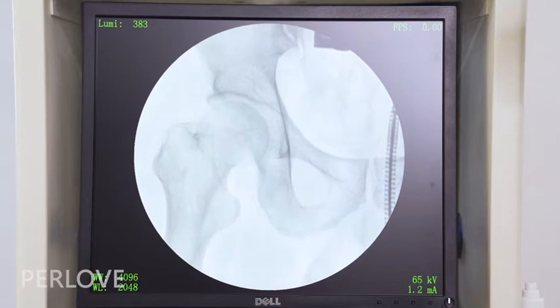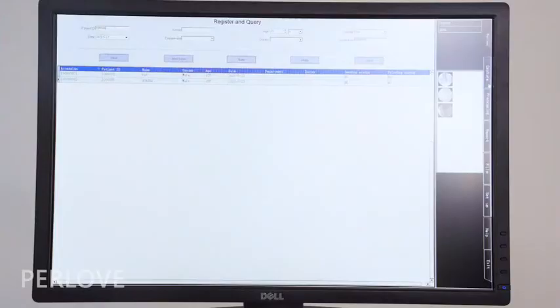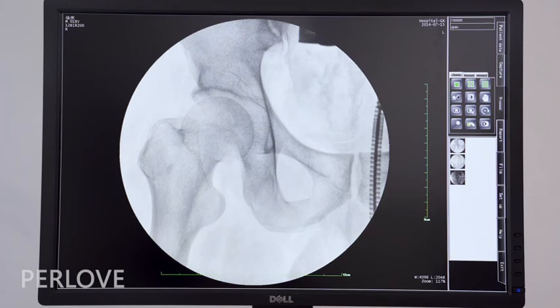The machine comes with LCD displays — the lower is the main screen while the upper is the auxiliary screen. This machine integrates the functions of registration, image collection, image processing, and case report printing. For image processing, you can utilize 4-window and 9-window views, sharpening, horizontal mirror, vertical mirror, text annotation, length measurement, and more.